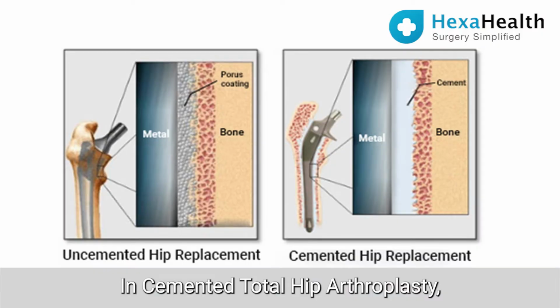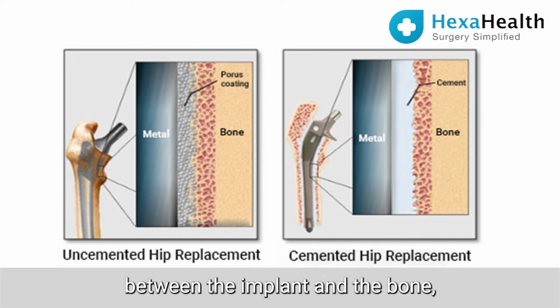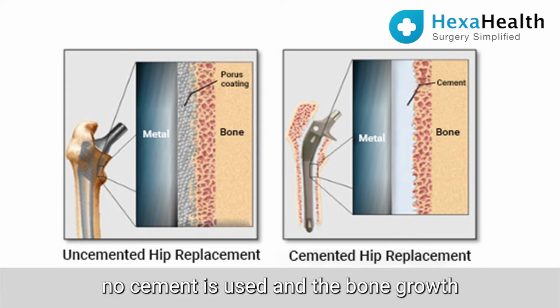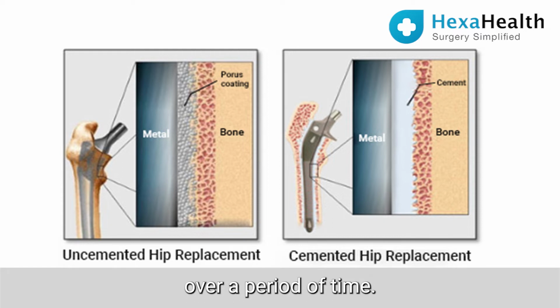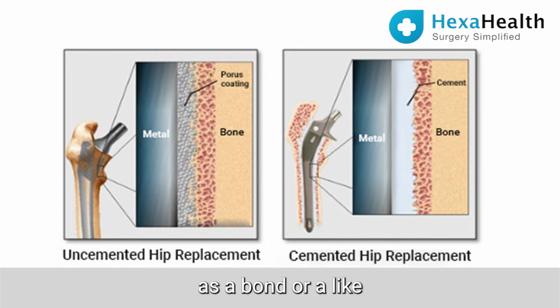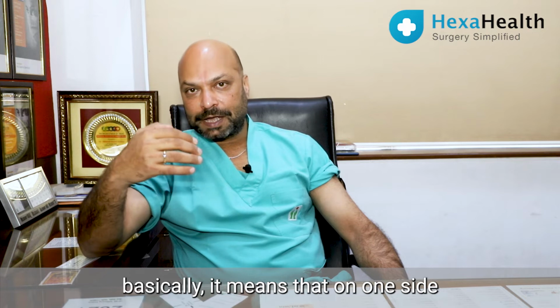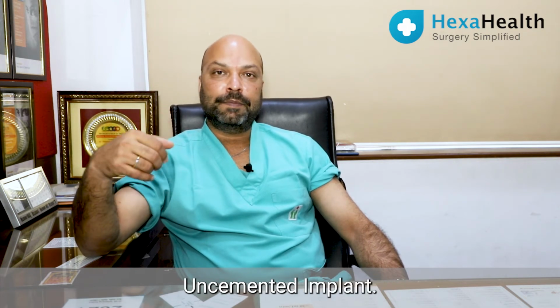In cemented total hip arthroplasty, cement is used to form a bond between the implant and the bone, whereas in uncemented total hip arthroplasty, no cement is used and the bone growth takes place over the implant over a period of time. So we are not using any cement as a bond to fix the implant to the bone. The hybrid type means that on one side we do a cemented implant and on the other side we do an uncemented implant.